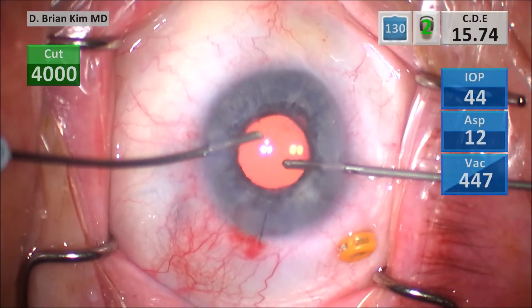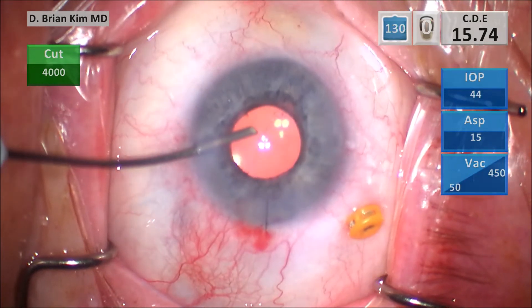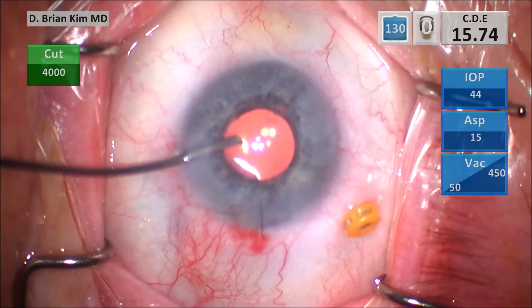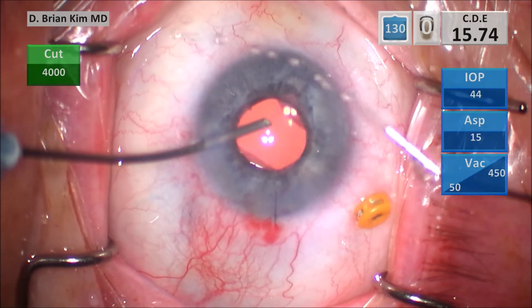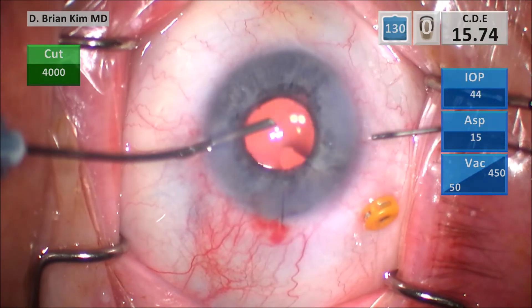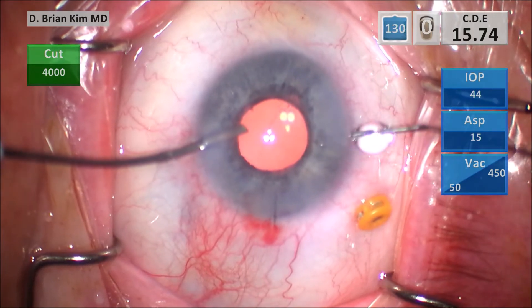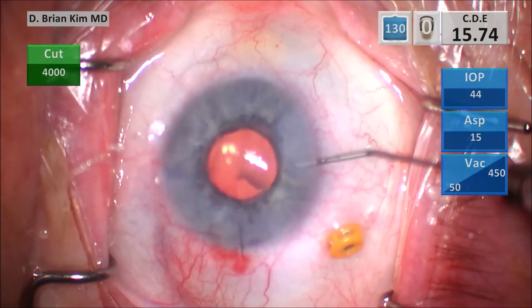Here I'm doing a peripheral iridectomy using the vitrector — making a nice discrete surgical iridectomy temporally. I did this because I have a sulcus lens and I want to make sure I don't have any issues with iris chafing to the haptics. I kept the AC cannula in the eye the entire time to maintain infusion pressure, because you don't want the chamber to collapse and cause vitreous to come forward, and to maintain the optic capture configuration.